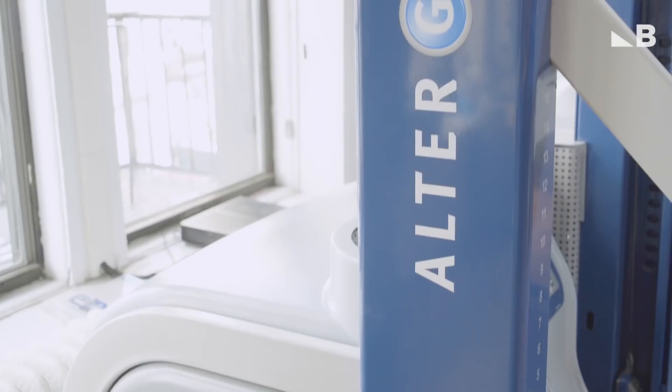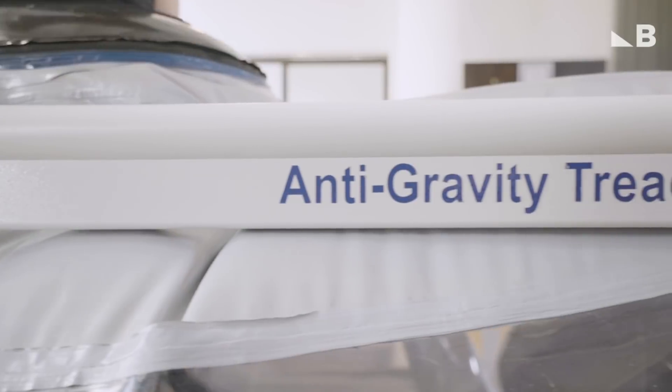We are here at Finish Line Physical Therapy in New York City, and we're here because they have an Alter-G, which is an anti-gravity treadmill, and we're going to give it a try.